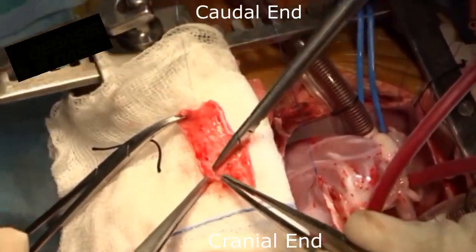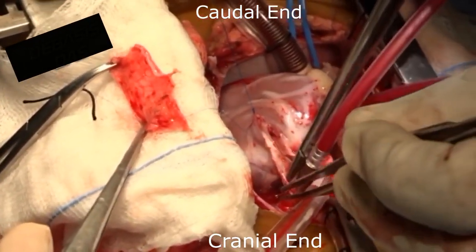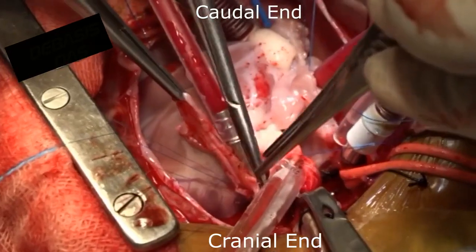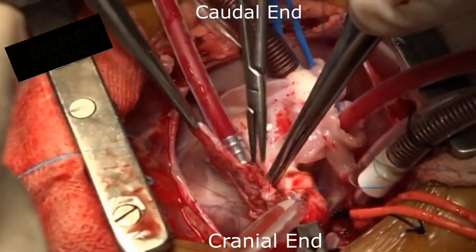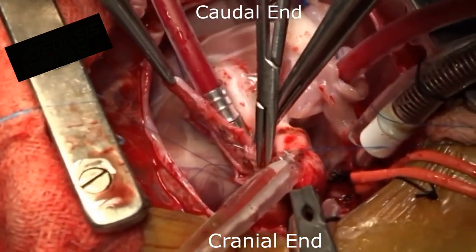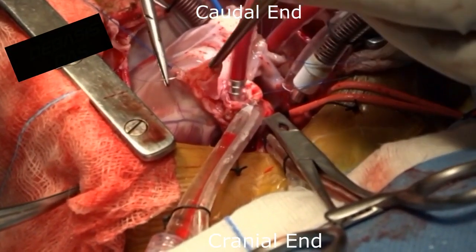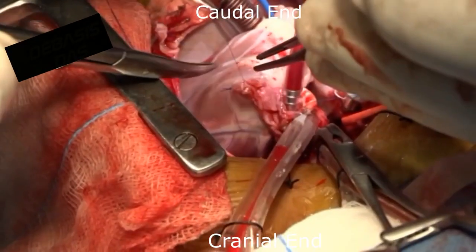The transannular patch is then sutured with 6-0 polypropylene suture in a continuous fashion. It is important to place equidistant sutures on the right ventricular outflow tract for a hemostatic suture line. The pericardial patch width should be just adequate without being excessively redundant. At the same time, it should not be too tight.